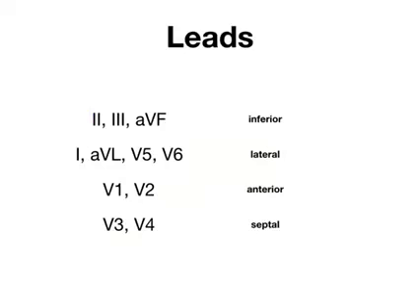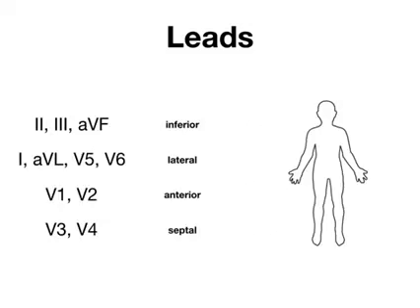But assuming that you do and you're comfortable with the way that these leads work, let's move on and talk about my mnemonic for remembering these leads. Because again, if you're not there yet, you have to have a way to memorize this because this is very important when you're taking your board exam. So I'm going to push that information to the left and draw my stick figure here.